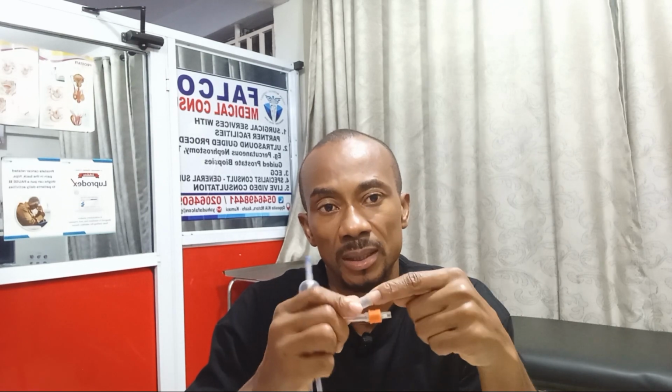It's advisable that if the capacity of the balloon has been reduced by a previous attempt, you add a few mils, let's say 20 mils, through the valve so that the balloon becomes more visible within the urinary bladder. Then it's also an advantage to have the bladder filled with normal saline, or you clamp the drainage port and allow urine to accumulate adequately. But usually it's fairly straightforward to connect. You remove the hard plastic part of the giving set, then connect the rubber components, and then instill normal saline by gravity. This will adequately fill the urinary bladder.